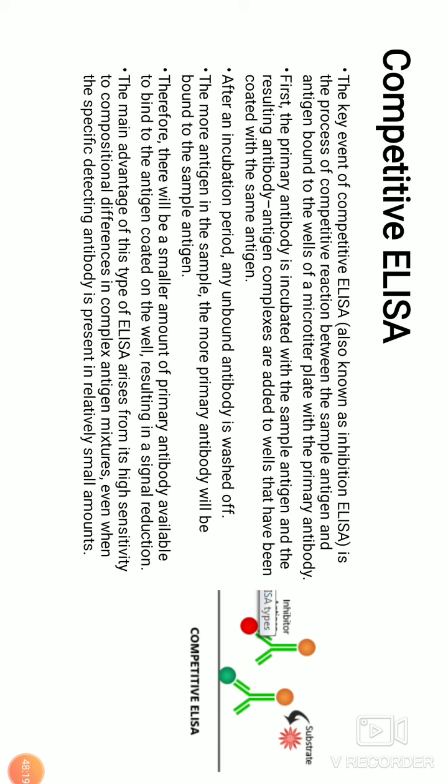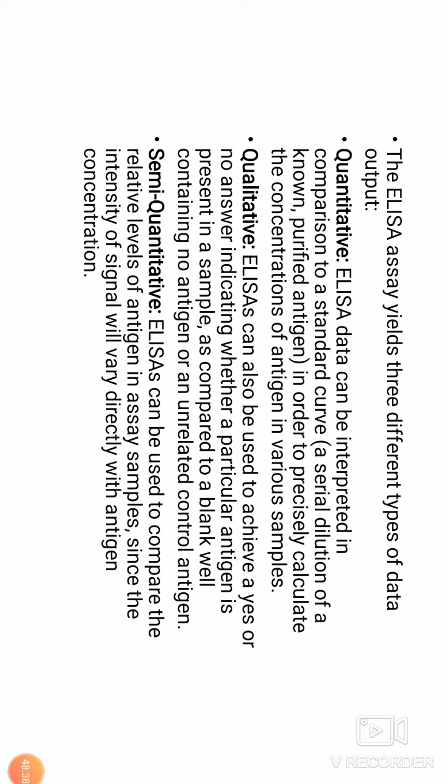The main advantage of this kind of ELISA arises from its high sensitivity, its ability to detect compositional differences in complex antigen mixtures, even when the specific detecting antibody is present in relatively small amounts. ELISA outputs can be quantitative, qualitative, or semi-quantitative. Quantitative data can be interpreted in comparison to a standard curve in order to precisely calculate the concentration of antigen in various samples. Qualitative ELISA can be used to get a yes or no kind of answer, whether a particular antigen is present in a sample, as compared to a blank well containing no antigen or an unrelated control antigen. Semi-quantitative ELISA can be used to compare the relative levels of antigen in assay samples, since the intensity of signal will vary directly with antigen concentration.